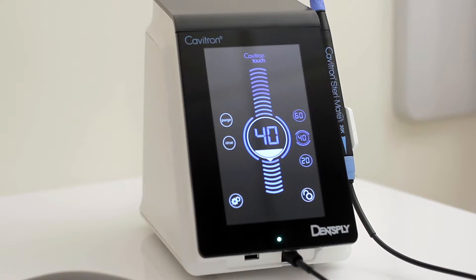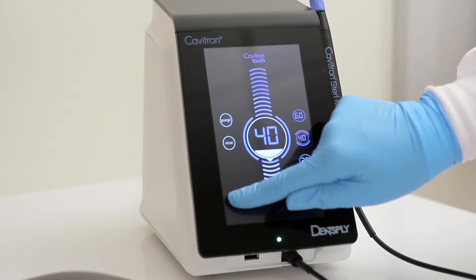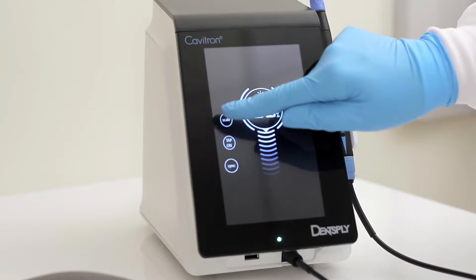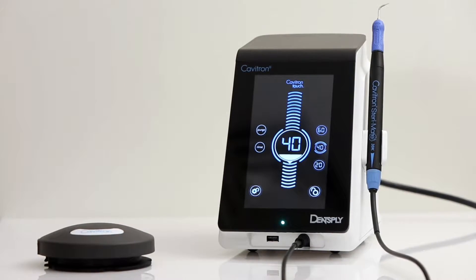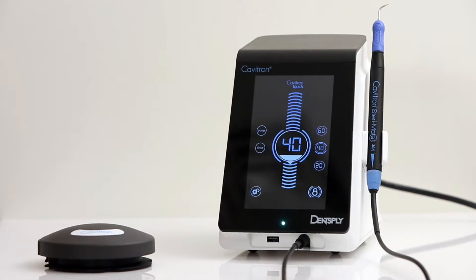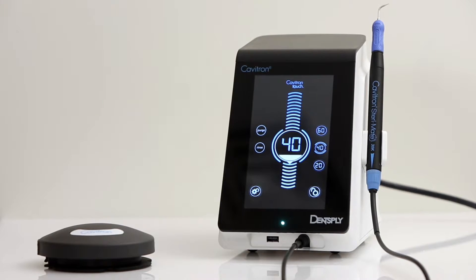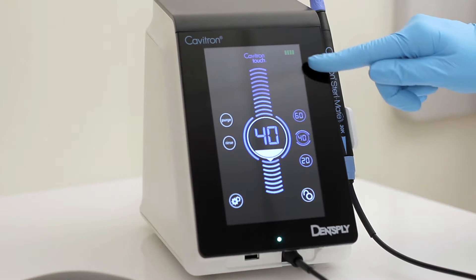To access the settings menu, press and hold the icon for 2 seconds. The lock icon is pressed and held for 2 seconds to lock the screen, disabling adjustment of any parameter, until the icon is pressed and held for 2 seconds. The upper right corner displays the battery level of the foot pedal.